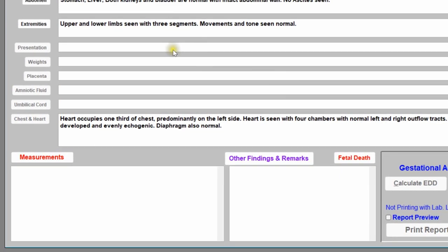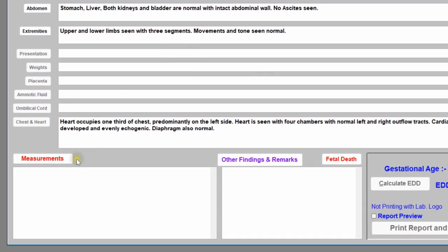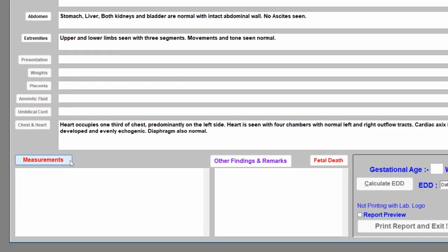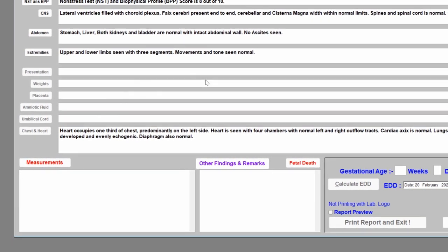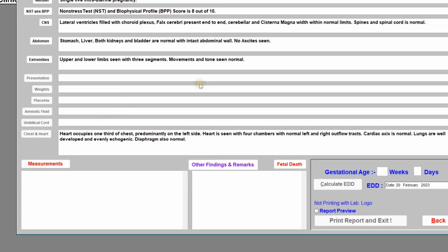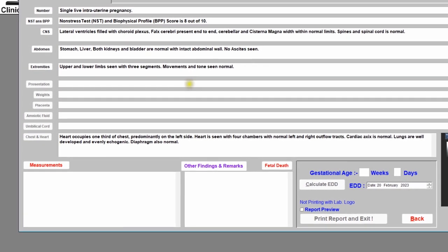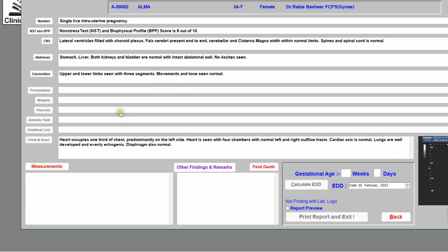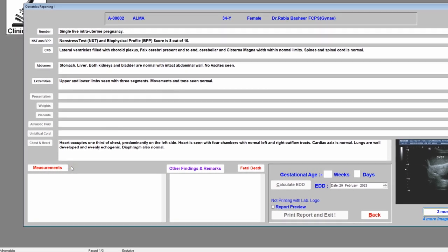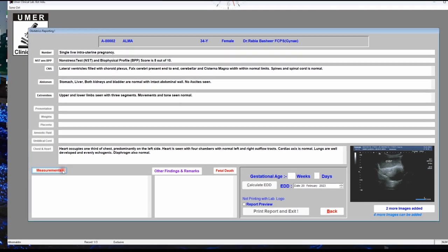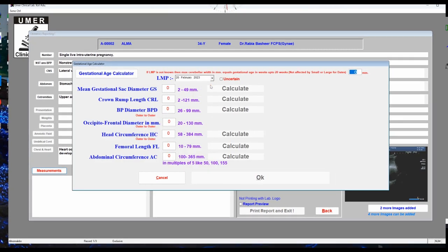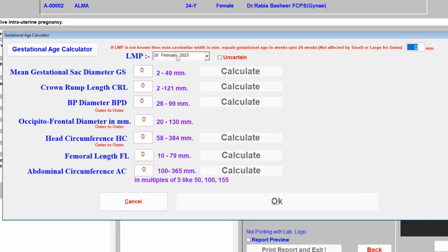Before editing any entry, first enter the biometry of the fetus, because every normal value entered in this patient report is based on the biometry findings. Click 'Measurements'. Here, first of all, you should enter the LMP of the patient if you know it.